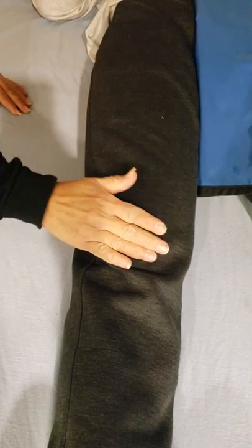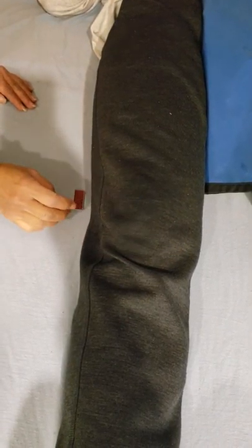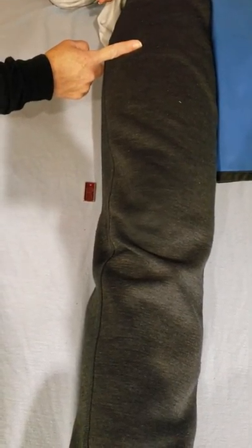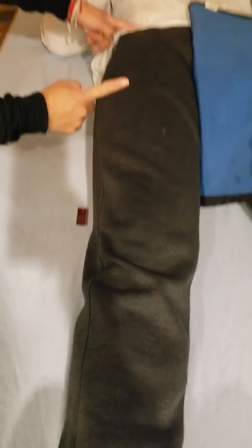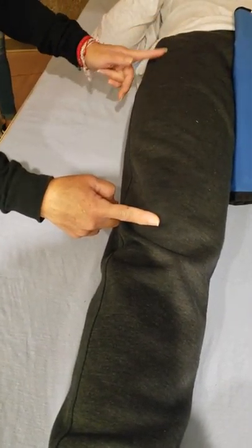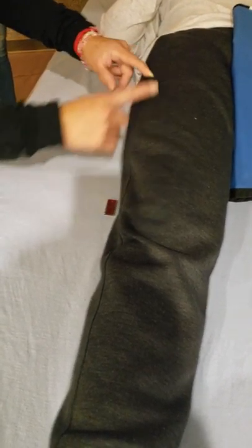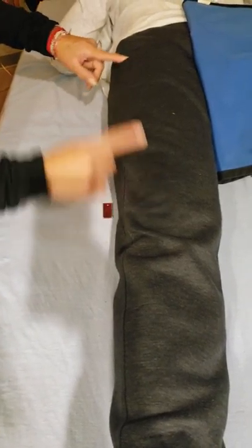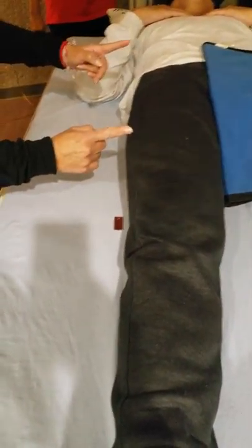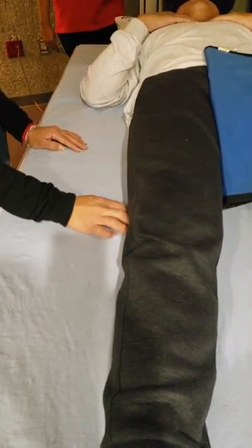In clinic, you might see where they begin from the knee up and then do a smaller film. They all need to be the same scale. When there are fractures involved, you want to use your longest film where the fracture side is, if you want to show the fracture entirely. Keep in mind that if it starts back over here or vice versa, it's the same concept.